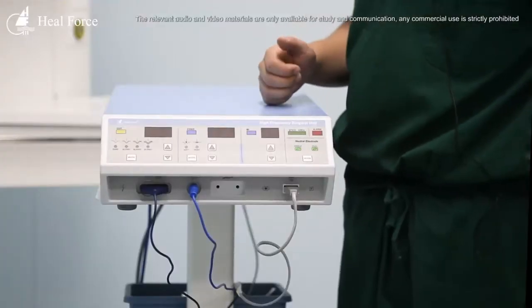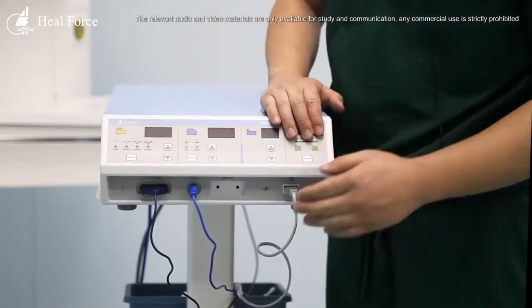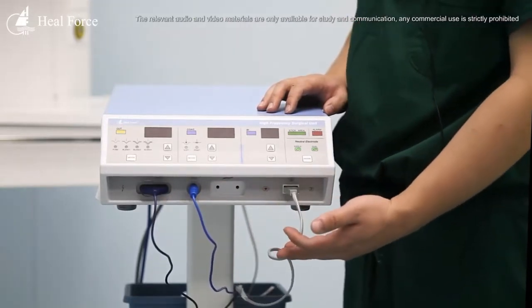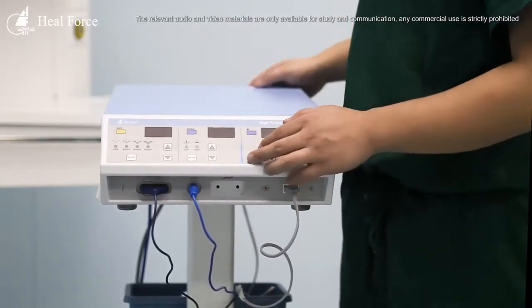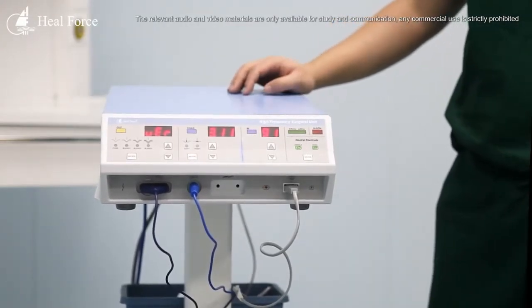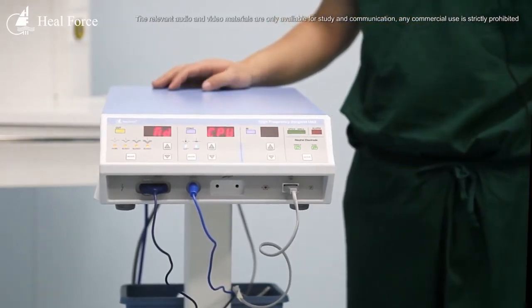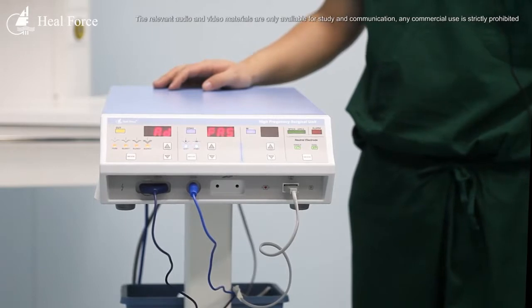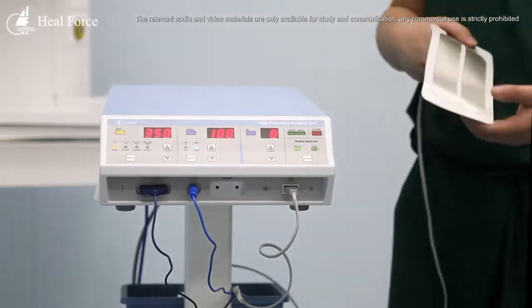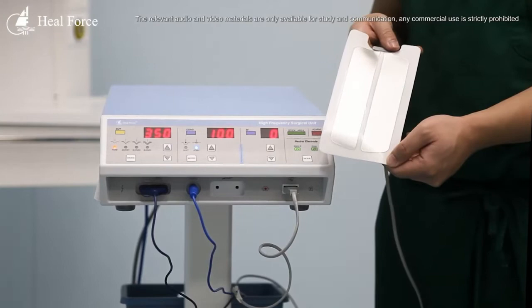Now we are looking at the EB03. We can see the control panel here. I have attached the pencil and the plate, and now I will turn on this equipment. You can hear the alarm because we have not attached the plate to the patient.